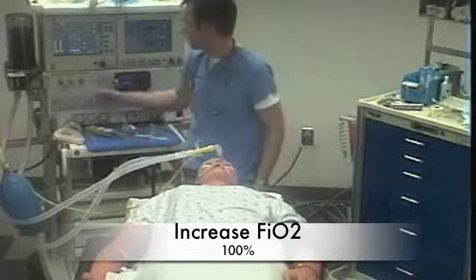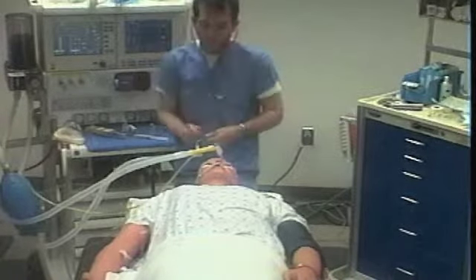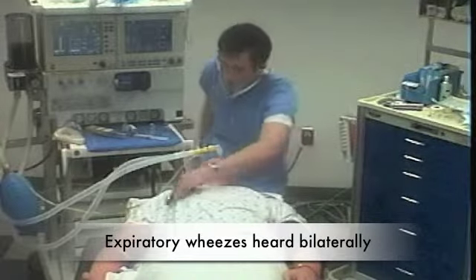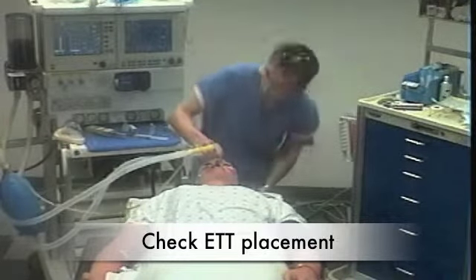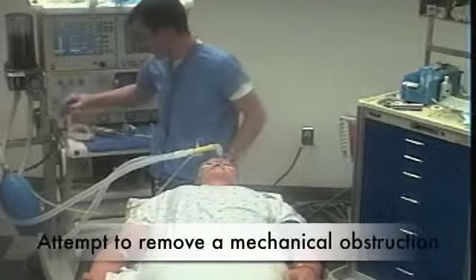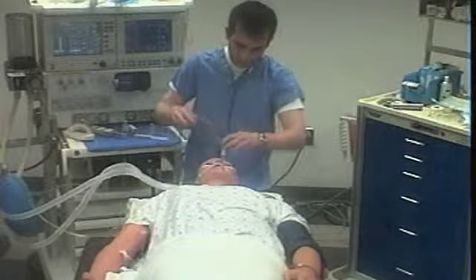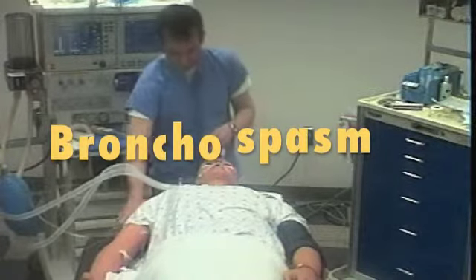First, you need to increase your FiO2 to 100%. Auscultate your patient's lung fields. Check to ensure that the ET tube is not endobronchial or resting on the carina, as it can move during positioning and surgery. Next, attempt to relieve any type of mechanical obstruction by suctioning or unkinking the ET tube. After you have completed these steps to rule out other potential causes of impaired ventilation, you can make the diagnosis of bronchospasm and begin your treatment.